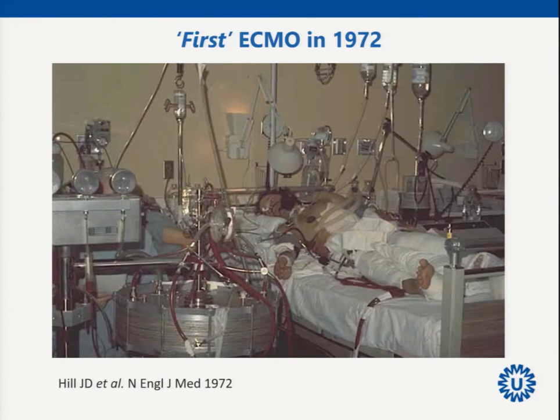So this is considered actually the first ECMO in the 70s. ECMO was actually described already in the 60s. This is a patient who suffered multiple trauma, especially chest trauma with an ARDS. And so this is a respiratory indication for ECMO.